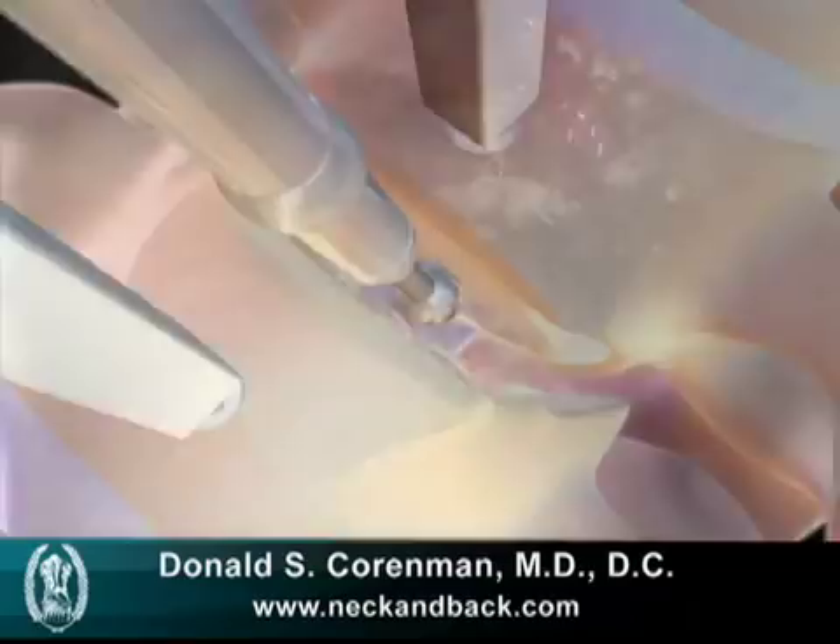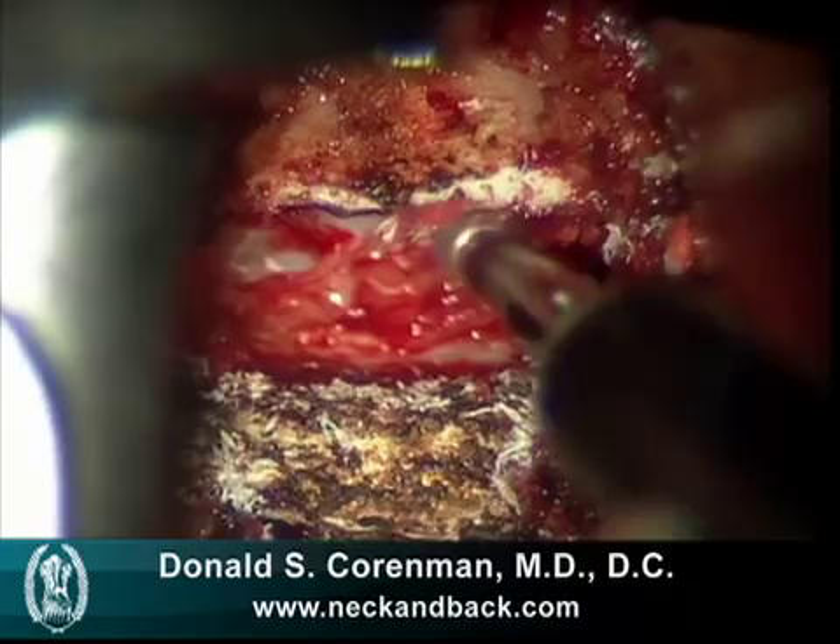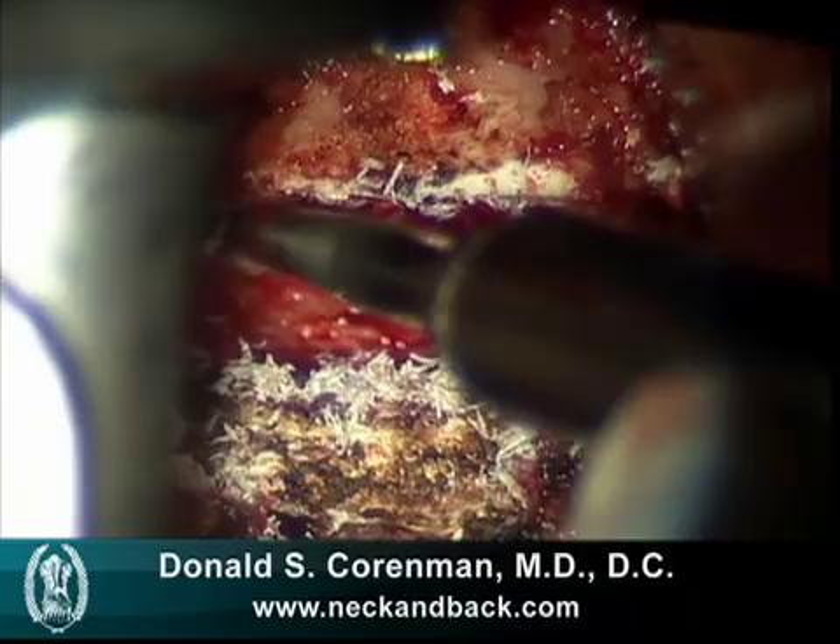We need to have the end plates parallel because the end plates in a typical cervical vertebra have some curve to them, and in order to be accepting of a good placement of a graft, we have to take these end plates down.